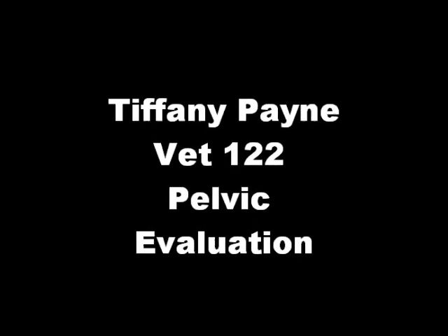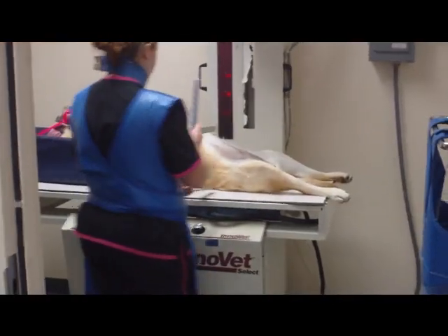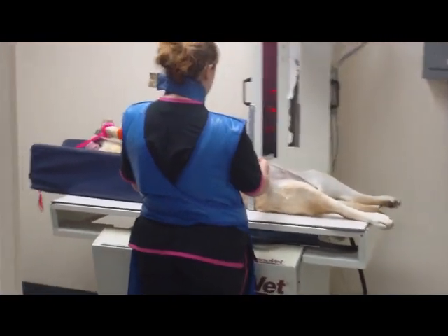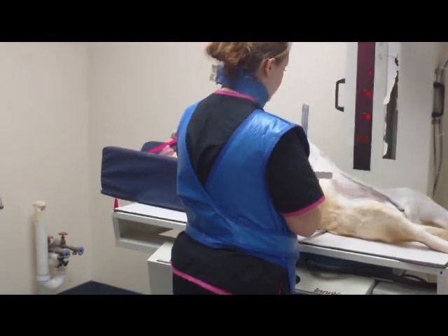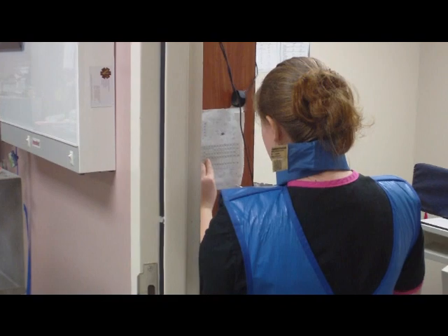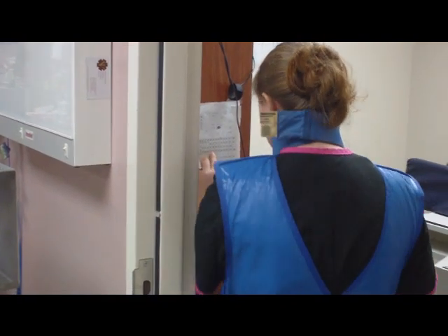This video will show proper positioning with measurement and radiographic techniques for a canine pelvic evaluation for hip dysplasia. I have already gowned up with my proper PPE, including lead apron, thyroid shield, and a dosimeter badge.